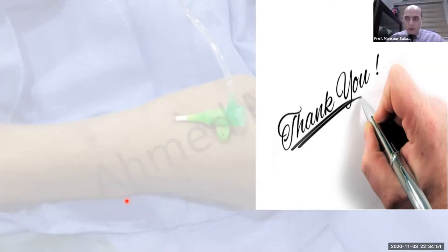Okay. So in cardiogenic shock, I think as you are aware, the electricity will be markedly less as compared to the active myocardium. So I think this case scenario started exactly as you mentioned, with ramus or diagonal or whatever. Then because the metabolic activity markedly declined, the electrical activity on the ECG was almost not active. So I think this made the ST segment just persist in one and AVL, that's it.